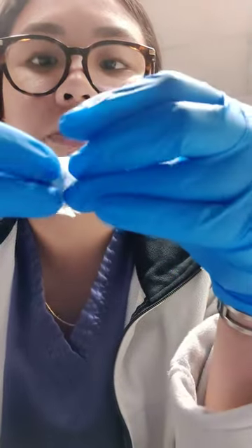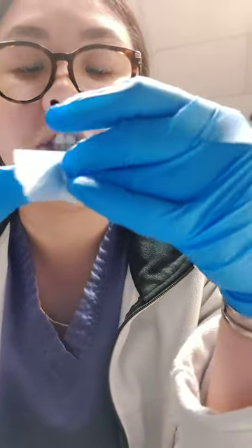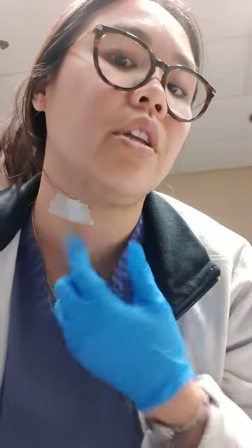So it's just a reference point for the radiologist to focus on. And like so. So the dot will go there and then you'll just mark it. And that's pretty much it. So yes, in CT we actually shoot BBs.